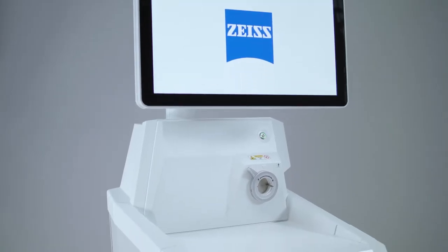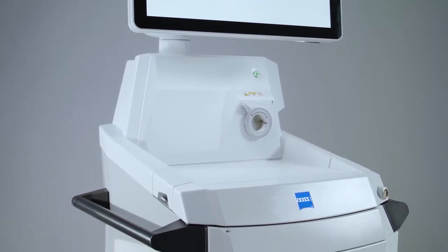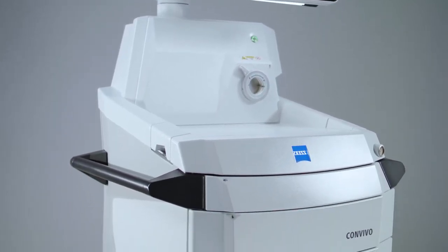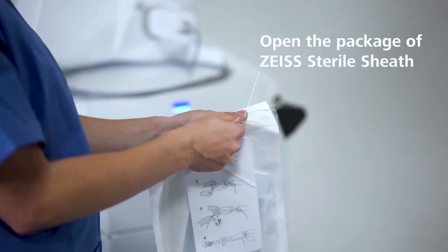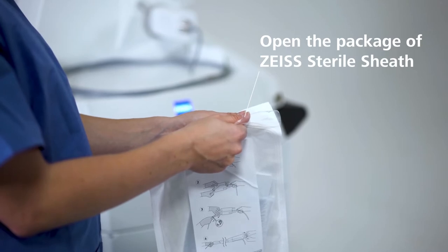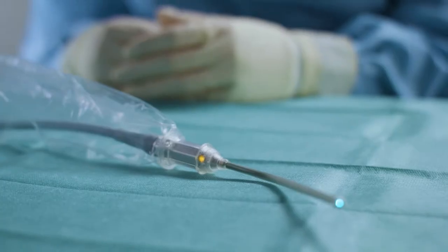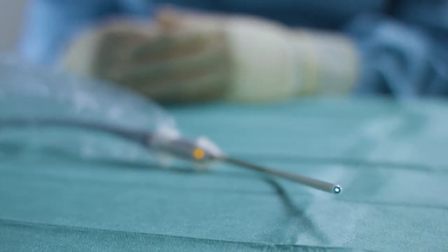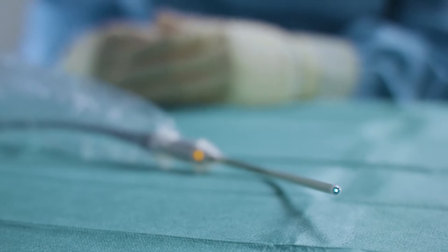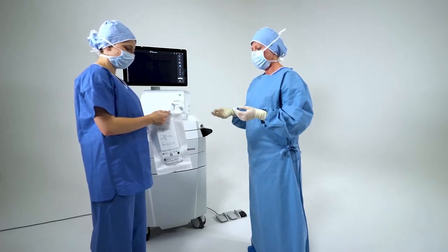To ensure sterility and reliable functionality of the ZEISS CONVIVO probe, the dedicated ZEISS Sterile Sheath is required. Exclusively use a new, originally packed ZEISS Sterile Sheath for ZEISS CONVIVO for every procedure. The lens at the tip of the sterile sheath is an essential component of the optical path of the surgical workplace. For correct draping, please follow the instruction on the package.